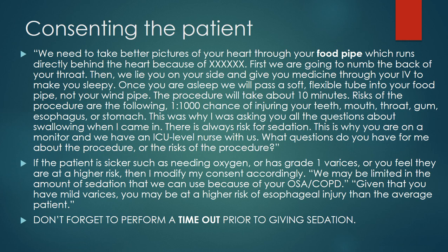And then lastly, don't forget to perform a timeout prior to giving sedation. So this, again, is not the nurse's responsibility. This is the fellow's responsibility or the physician's to do ahead of time.